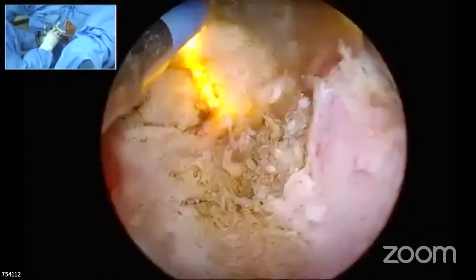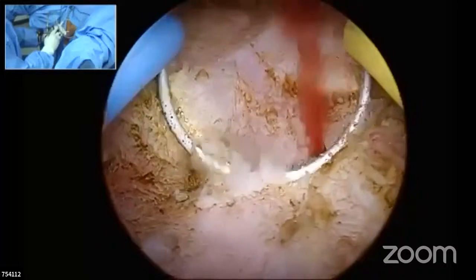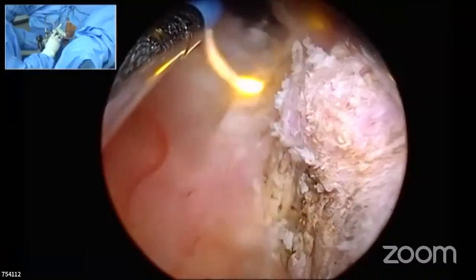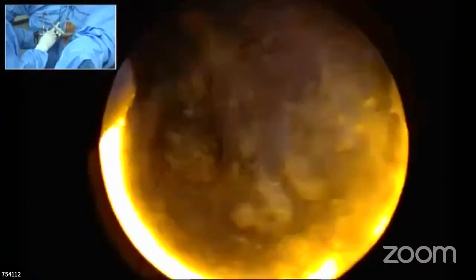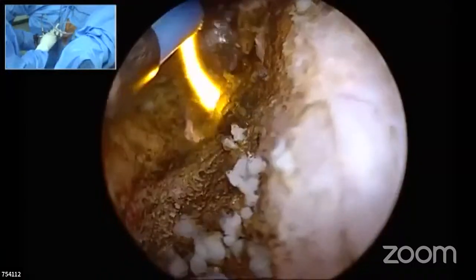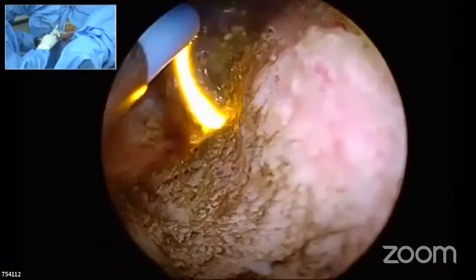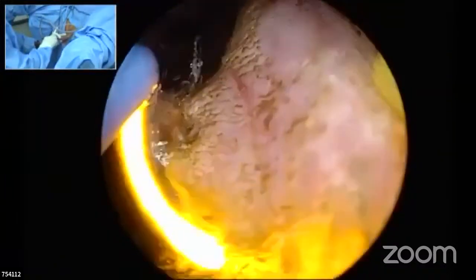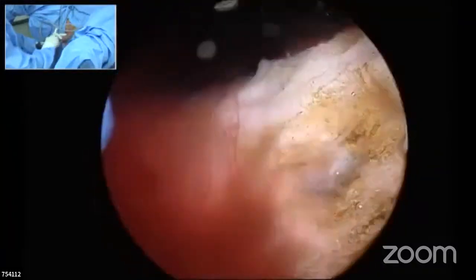I'll give you one more technique. Whenever you start resecting, don't use the whole loop to resect. Let me fulgurate this and then show you how. Okay, you have done one resection here. Keep half loop to cut the tissue, half loop to be seen. This gives you the correct way to know how much depth of tissue you are cutting. The same way I'm doing it. Half loop inside, half loop outside. You very well know how much is the depth at which the loop is moving. That gives you an advantage and an understanding of how much is going to be cut or how much is being resected. So you got that point?